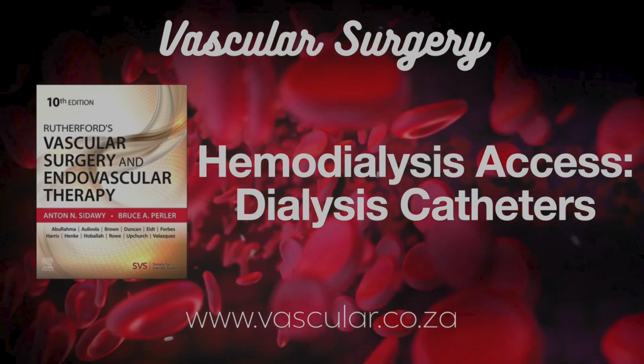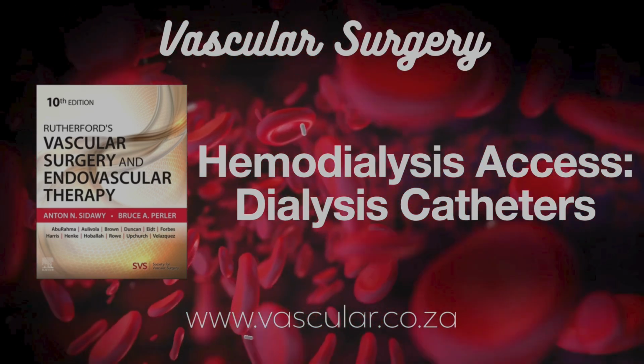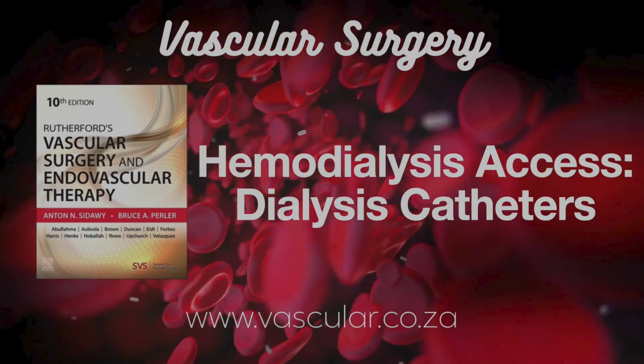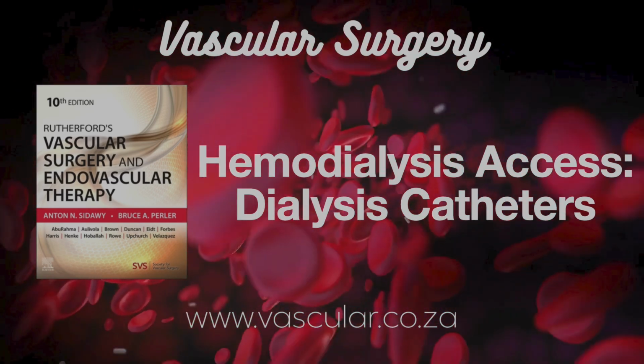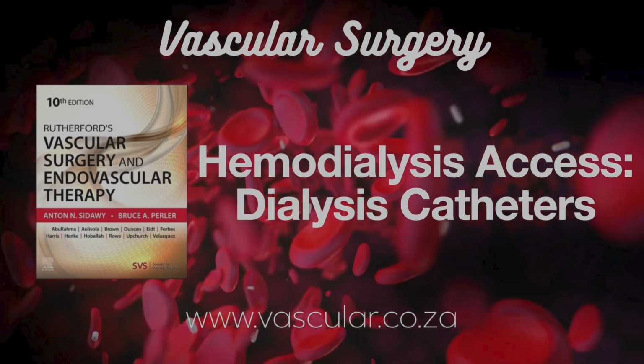And how do those catheters fare long term? They can be lifesavers, but generally their lifespan is shorter than IJ catheters. They also tend to need more interventions, adjustments, exchanges due to clots, migration, or infection. Exchange of a translumbar one can be particularly tough because of scarring in that retroperitoneal space.